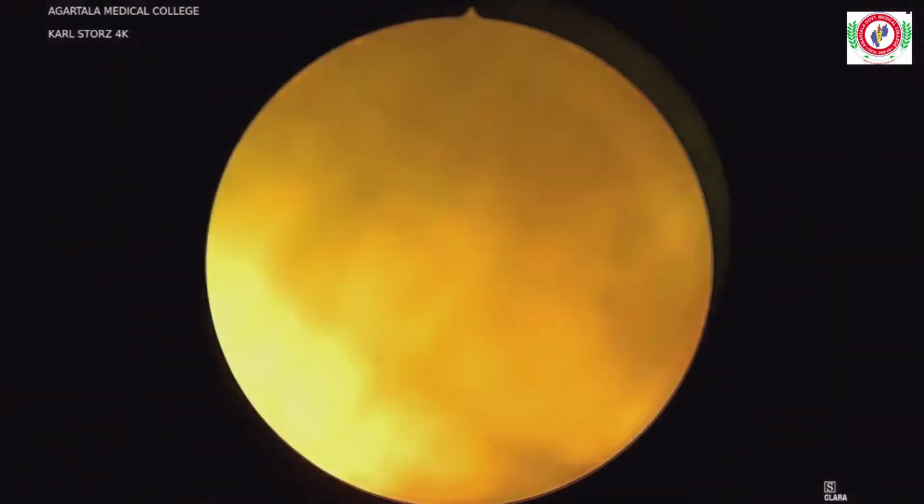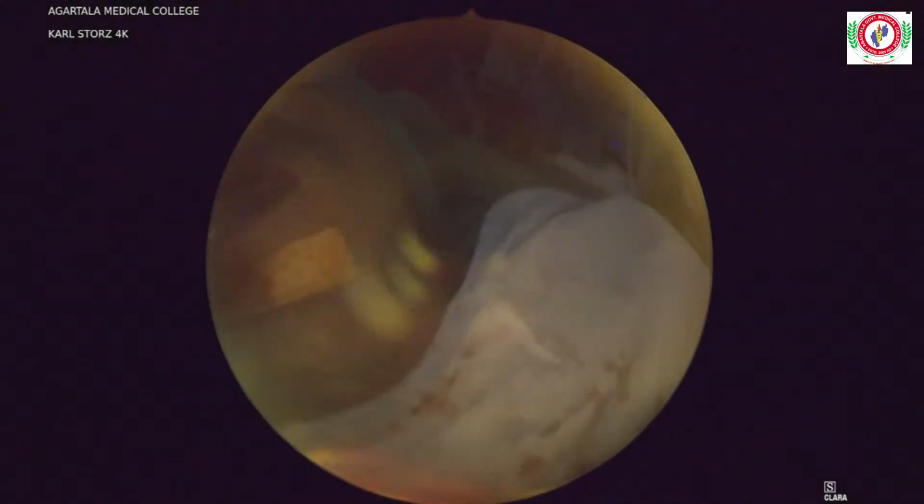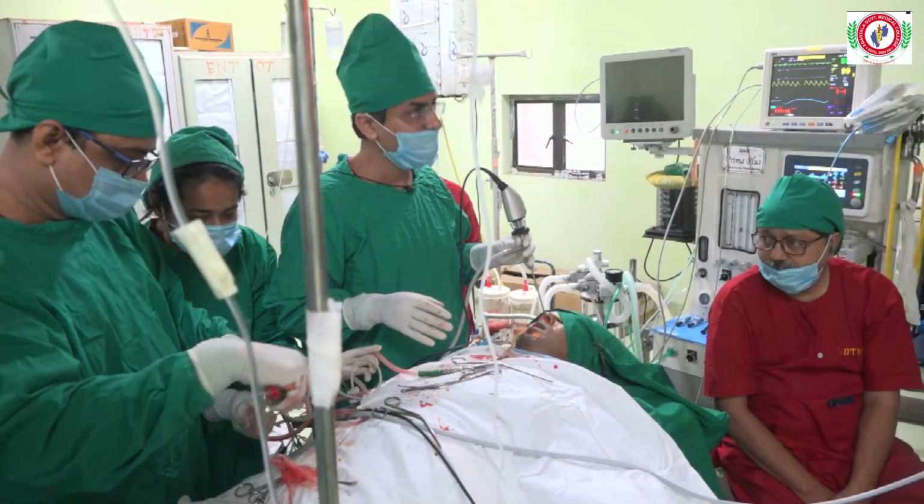Okay, so I'll take 2 minutes for the hemostasis to happen here, and then we'll remove the final part of the tumor.